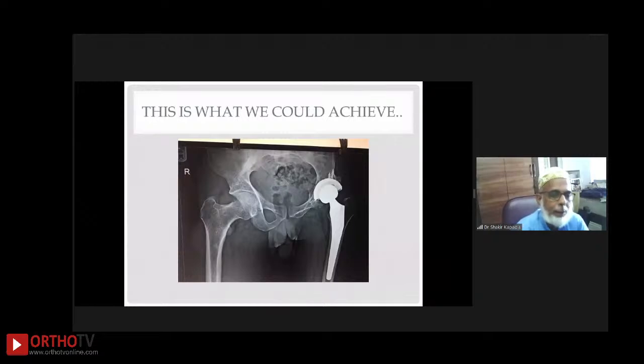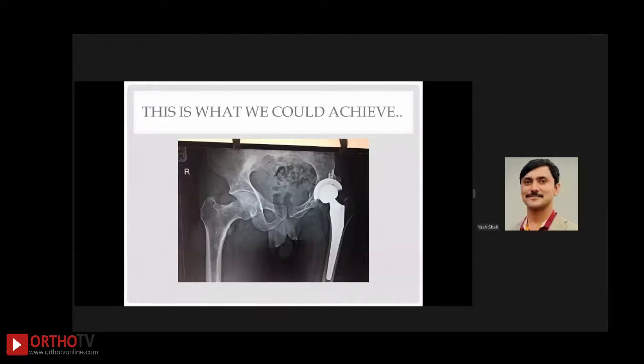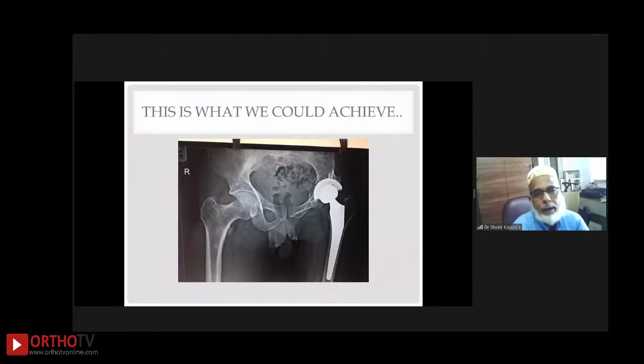Usually it is quite easy to make out that now the head is over and now you are in the acetabulum. Because the quality of your reaming immediately changes. Suddenly you come across a little bit of sclerotic bone which was not there before. Sometimes you can see a faint cortical area in the middle suddenly. Yeah. And now that is where I've reached the acetabulum. And then you get your bearings very easily from there, I think.